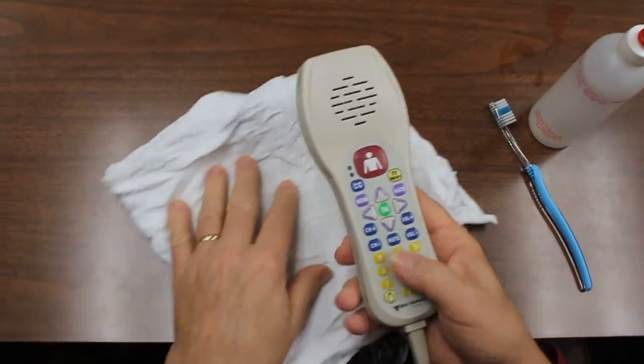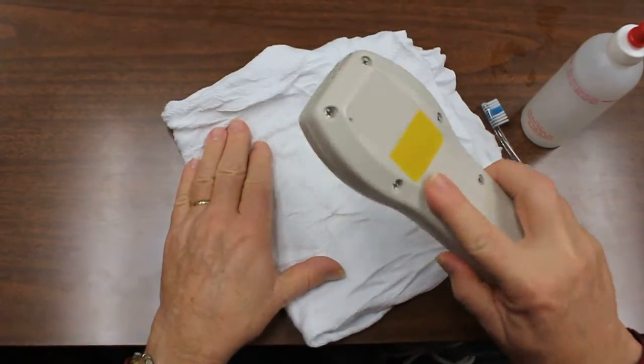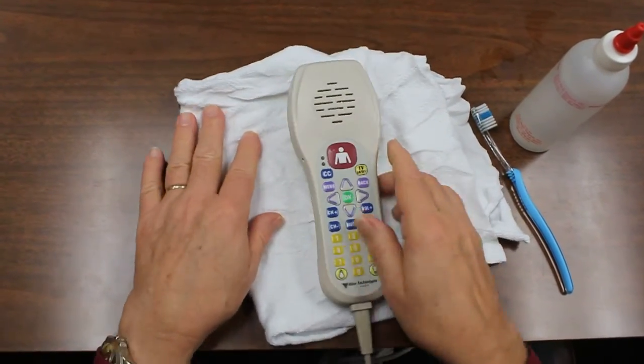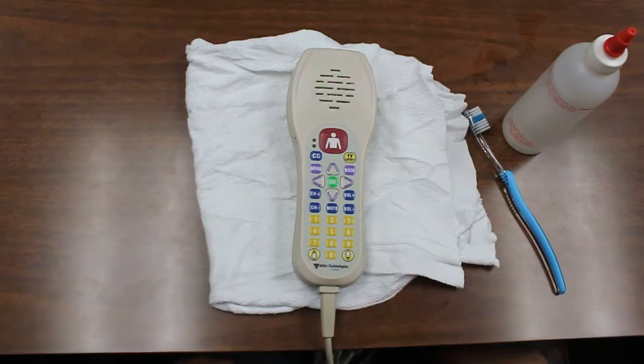If there is any alcohol in the speaker, you can turn it over and simply shake it out. However, the alcohol will dry by itself and you'll have a nice clean disinfected speaker.